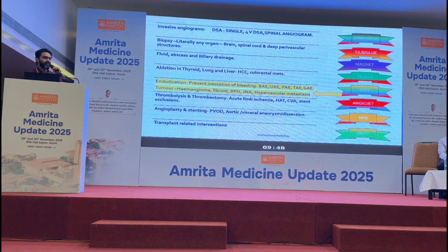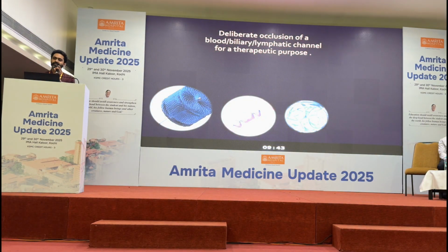Let's get into the various embolotherapies which we do. Now, what is embolization? Embolization is nothing but a deliberate occlusion of a vessel, a biliary system or a lymphatic channel for therapeutic purpose. For embolization, we might use different materials. It might be solid or liquid.